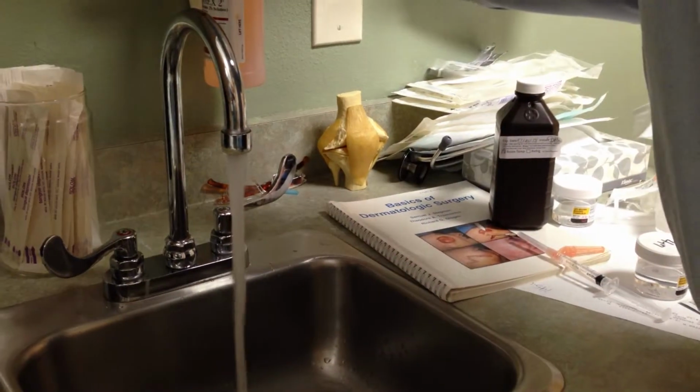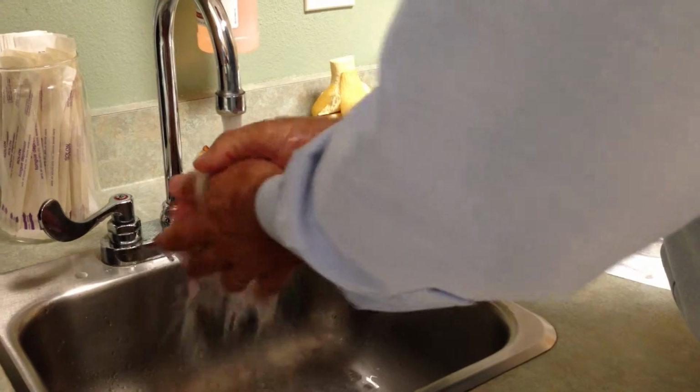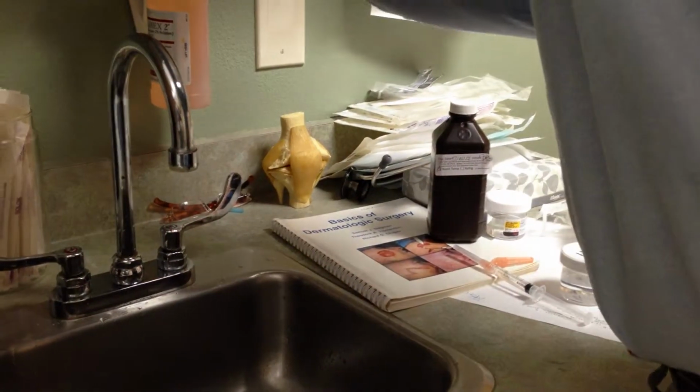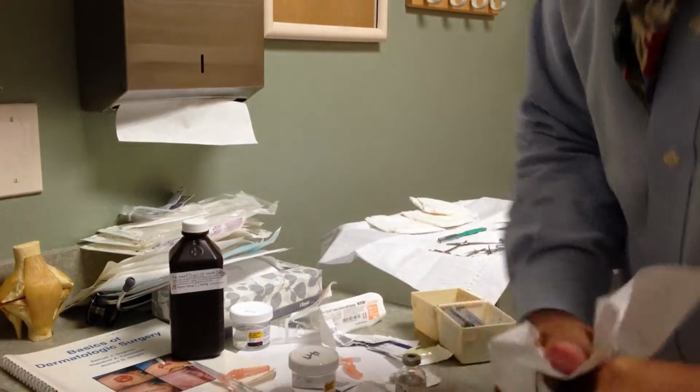Before touching the patient and all these things, it's always a good idea to have nice clean hands. Obviously I'm going to be wearing gloves in a minute, but for this early preparation part it doesn't hurt to keep the germ count down. And if you ever wear gloves with wet hands, you won't get your gloves on very well, so it's good to have nice and dry hands.